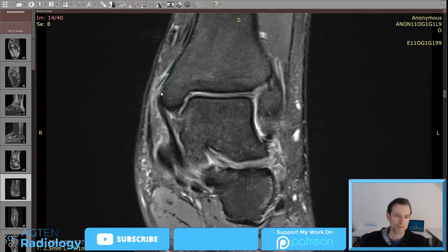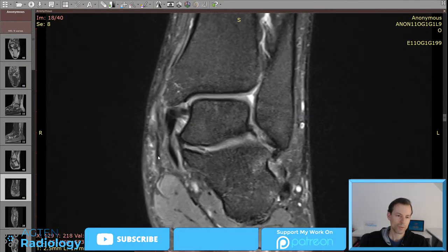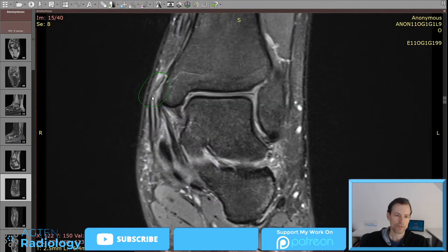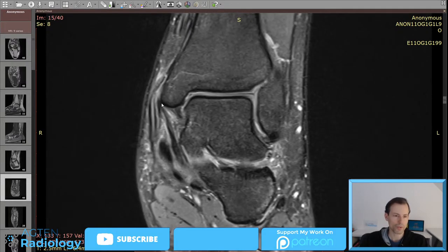So you can see the bone is coming down here nicely. And here, this is the fascia and the retinaculum, etc. You can have stripping of these structures from the underlying bone. This is known as the fascial sleeve of the medial malleolus, and it can be avulsed or stripped off. Normally it should be more like this, and it's elevated here. This can lead to chronic pain at the medial malleolus after a ligament injury, and it's hardly ever reported. It might be different depending on where you get your images from, but if you get any priors of relevant ankle injuries, go and have a look there.